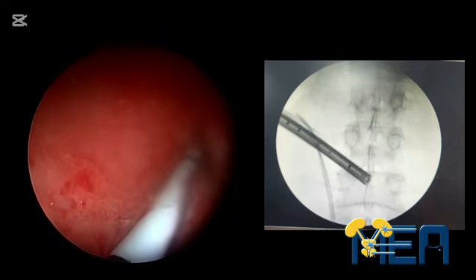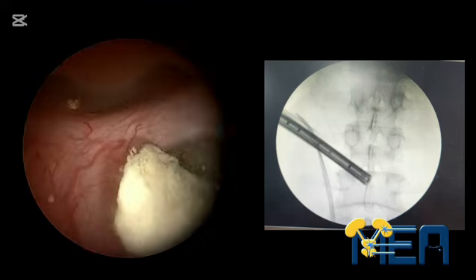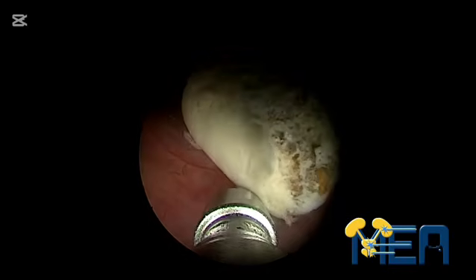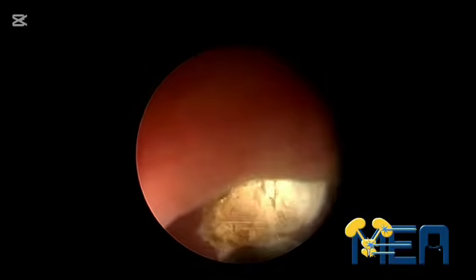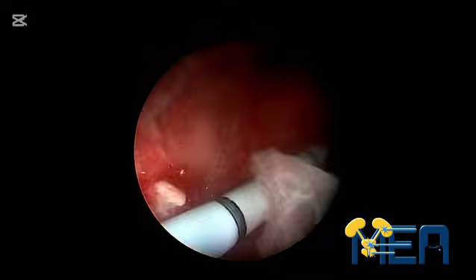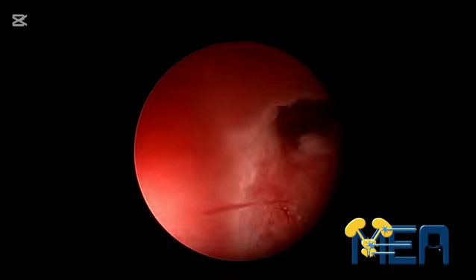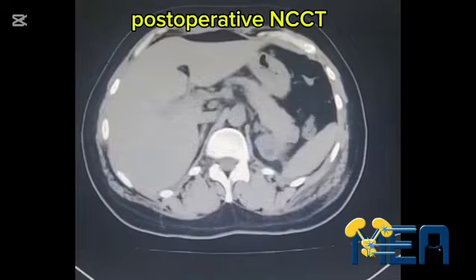Finish the renal pelvis stone, then look for the stones in the lower calyx. The neck of the lower calyx is located medially. Ultrasound disintegration and forceps extraction of the stones. Final scanning and fixation of the nephrostomy tube. The post-operative control film, non-contrast CT, is free.